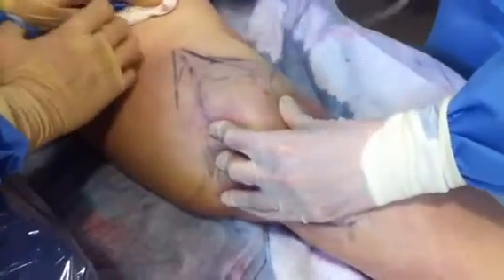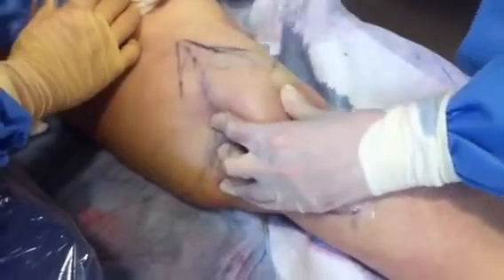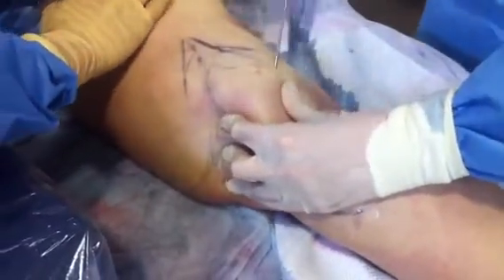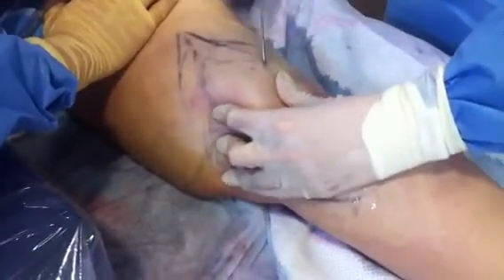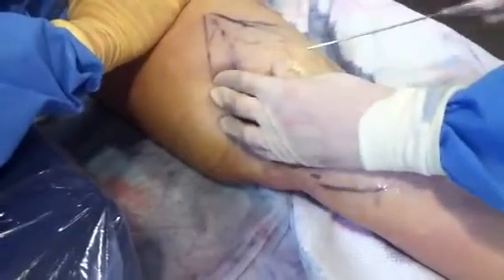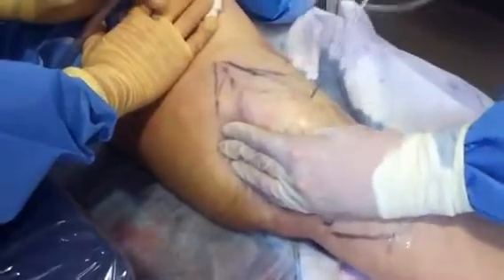We just very gently start to remove this fat. We've actually already done the other knee and got a surprising amount of fat in that area. It looks really pretty — just nice and flat now. We just wanted a smooth, sort of tapered look as we come down the side.